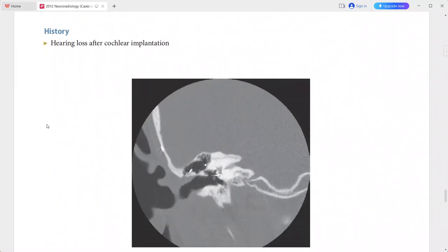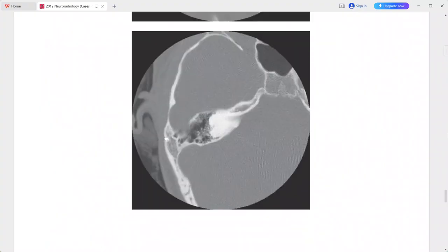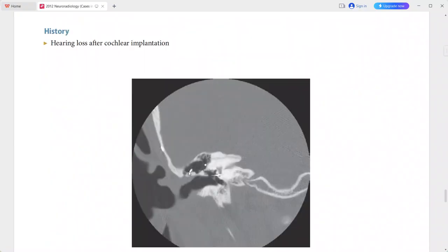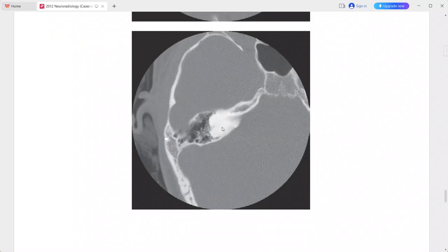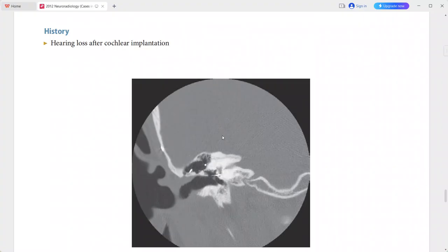The final case is a patient with hearing loss after cochlear implantation. There has been prior placement of a cochlear implant, and there is now abnormal ossification obliterating the semicircular canals and the majority of the cochlea. This is a case of labyrinthitis ossificans. Differentials include cochlear hypoplasia or cochlear aplasia.